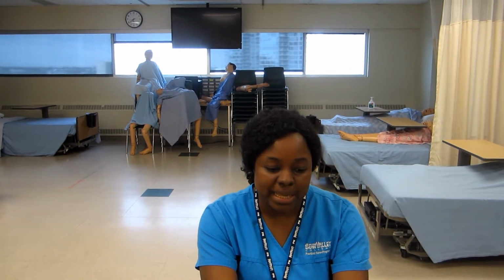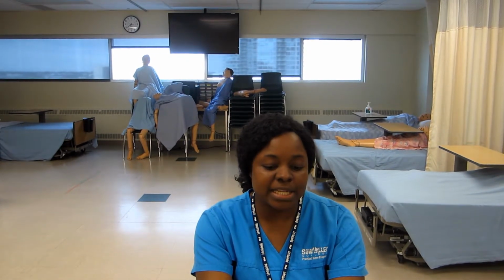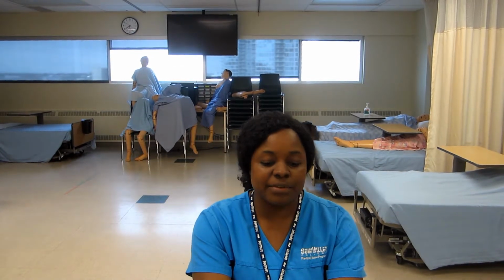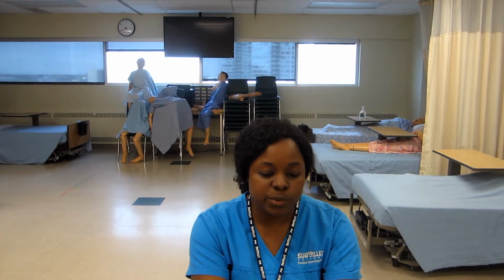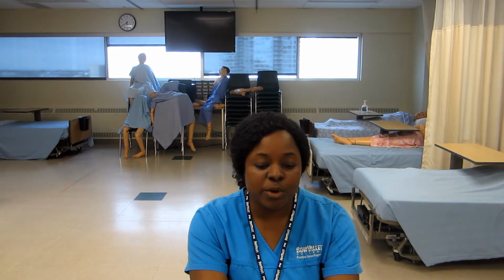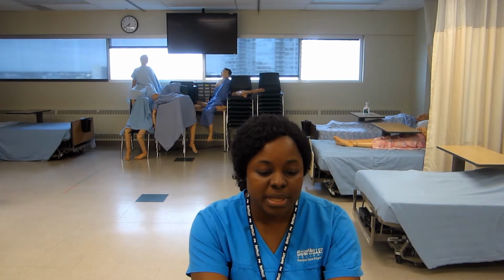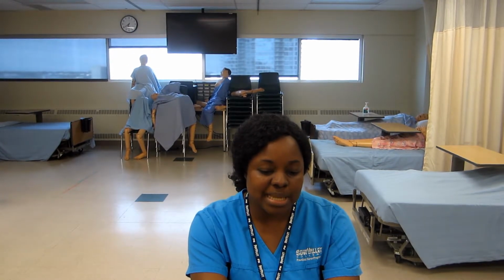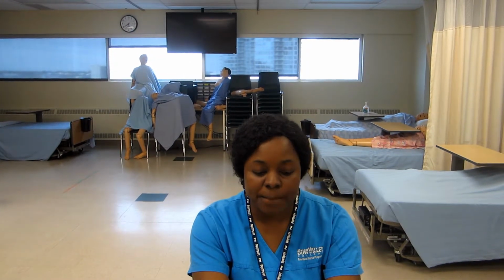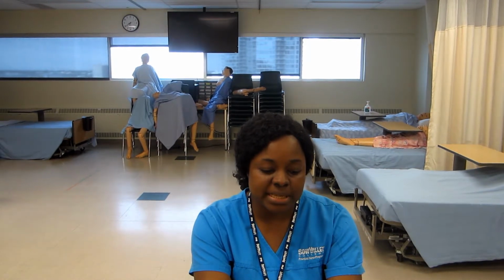at the bedside. Position the chair near the bed and allow adequate space to maneuver the lift. This ensures a safe environment for safe use of the lift. You can then raise the bed to an appropriate working height with mattress flat and lower side rails. This maintains the nurse's alignment during the transfer. Keep bed side rails up on the side opposite you to maintain patient safety.